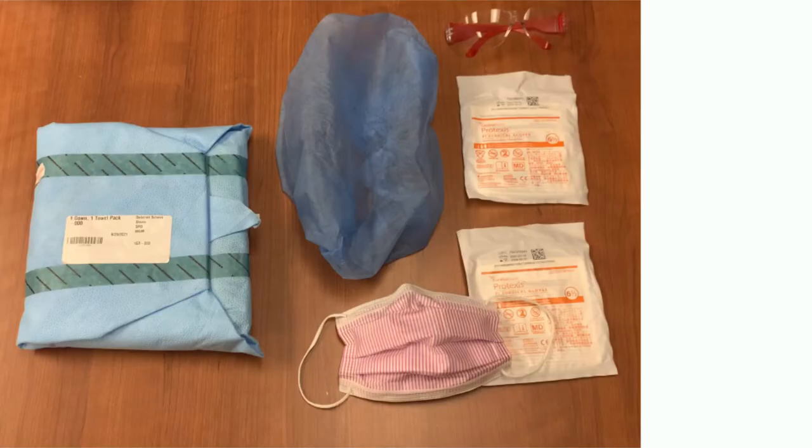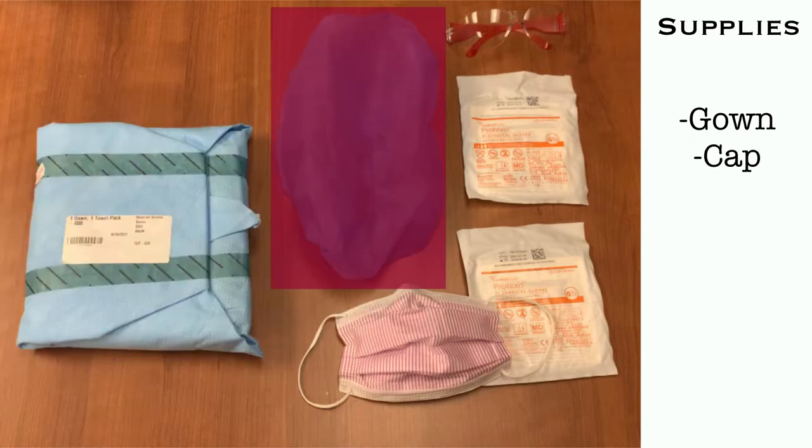In this video, the proper method of donning sterile PPE will be demonstrated, as well as some of the common issues you should avoid. Before you begin, the necessary supplies will need to be collected. This includes a sterile gown, a bouffant cap.